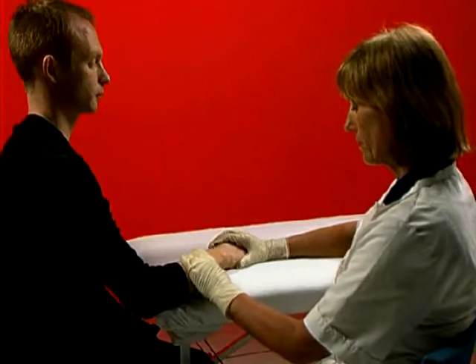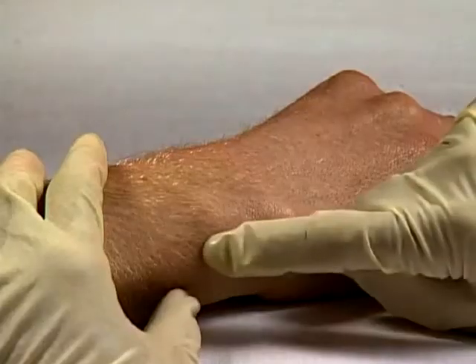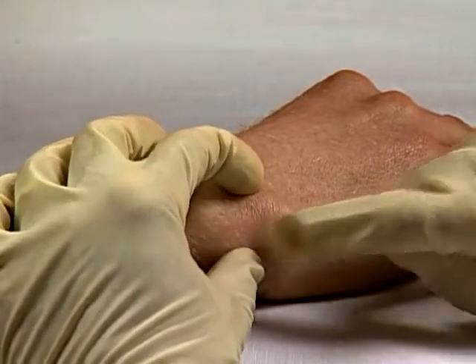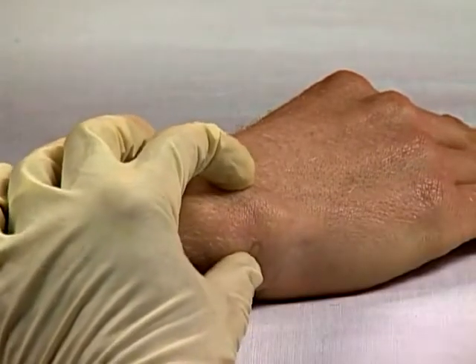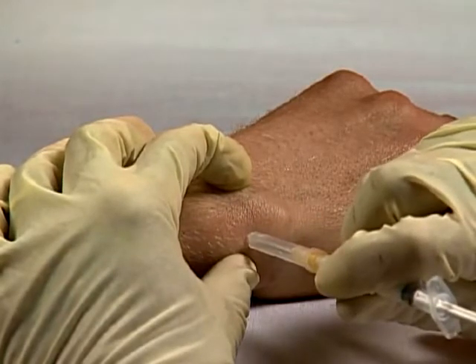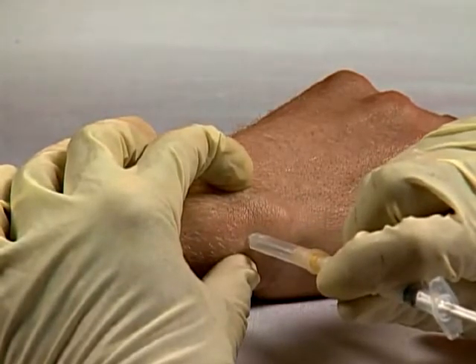Place the wrist in slight radial deviation. Find the joint line distal to styloid process of the ulna. Mark entry point here, clean and firmly stretch skin, and rapidly insert needle perpendicularly. Aspirate and inject as a bolus.